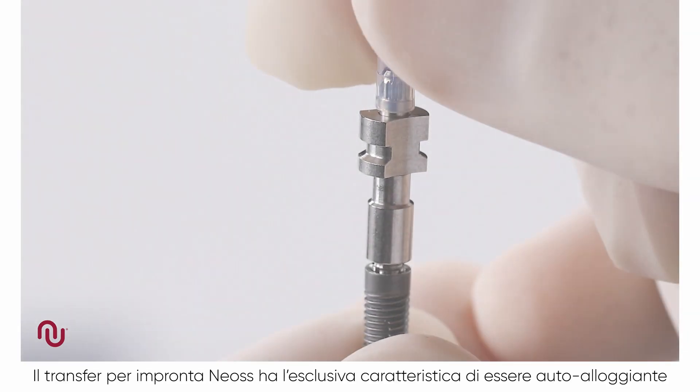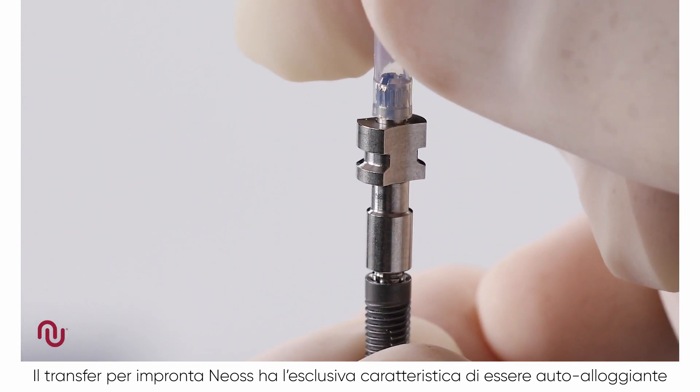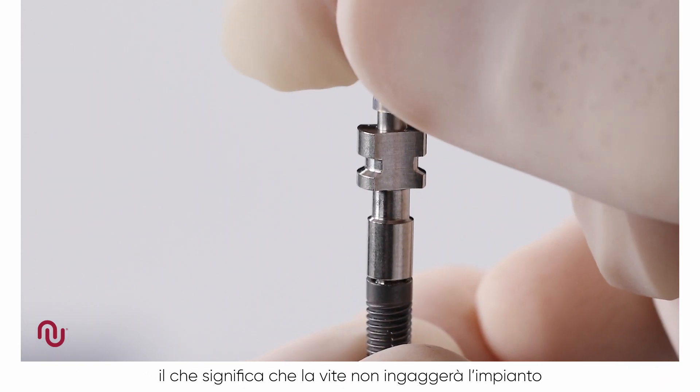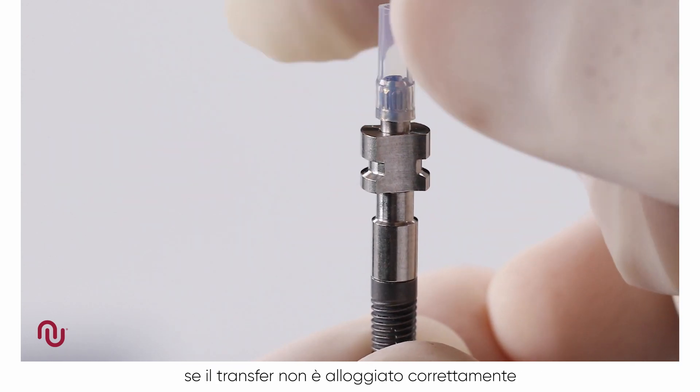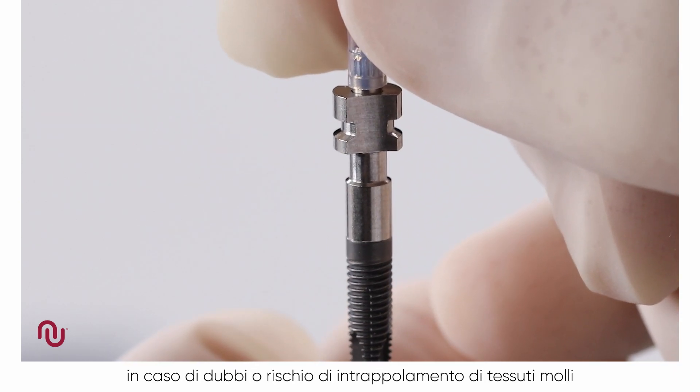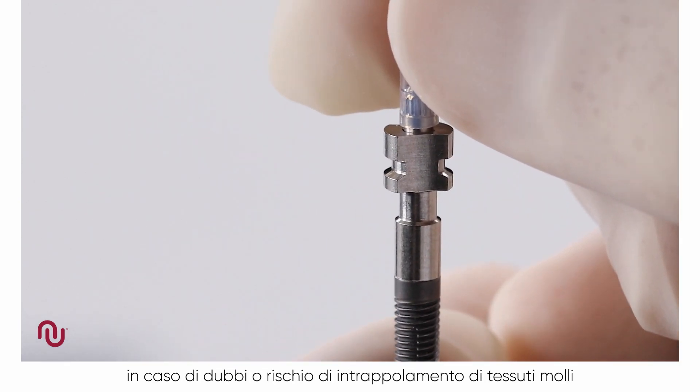A unique feature of all NEOS impression copings is that they are self-seating. This means that the screw will not engage the implant if the coping is not correctly seated. However, a radiograph is recommended if there is any uncertainty or risk of soft tissue entrapment.